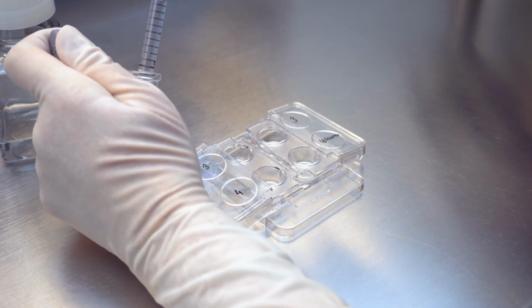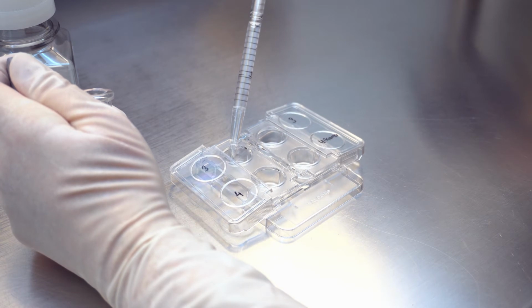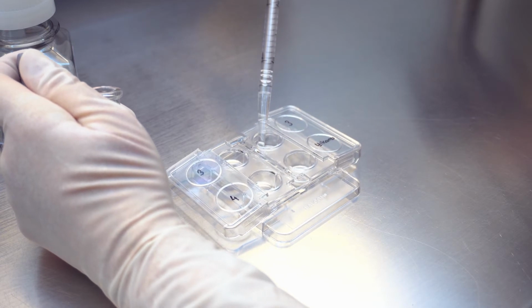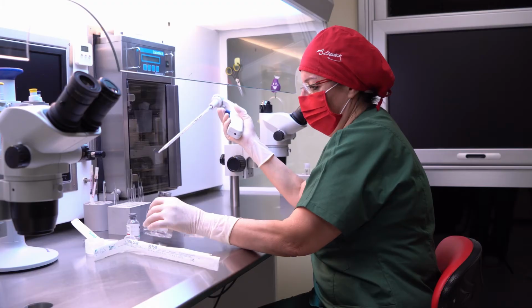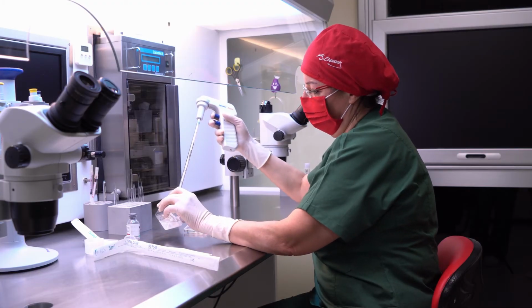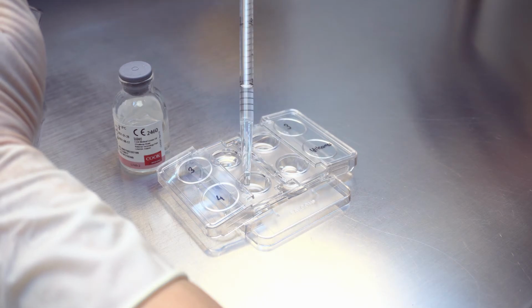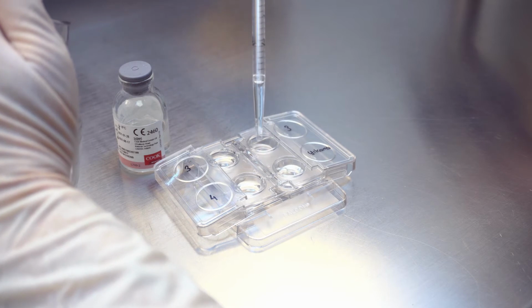Each well is filled with 0.5 milliliters of fertilization medium. Afterwards, each well is covered with a layer of 0.3 to 0.4 milliliters of mineral oil.